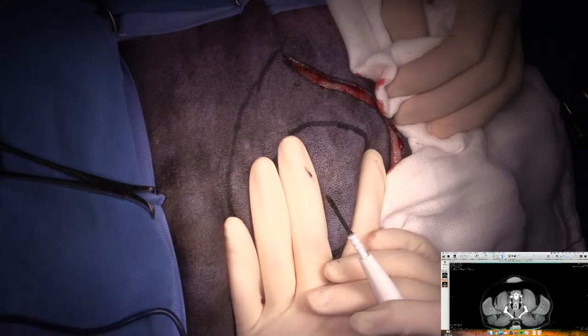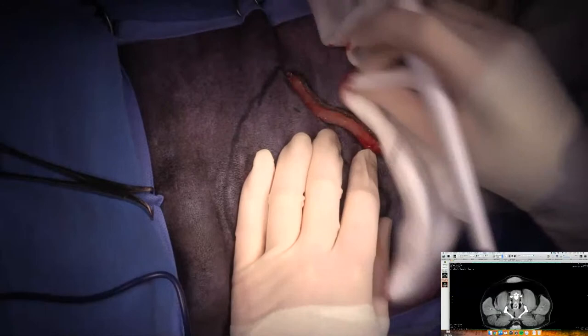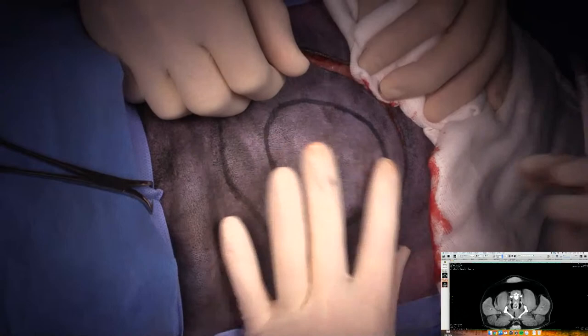So question about what's our favorite type of suture. We use PDS. PDS is the longest lasting absorbable suture that we have or that exists. And so that's the one that we tend to use in most situations, unless we're doing just an intradermal closure in a patient that doesn't have any issues with wound healing, we'll use Monosyn, which lasts a shorter period of time.